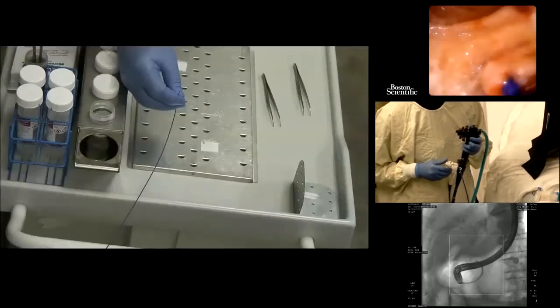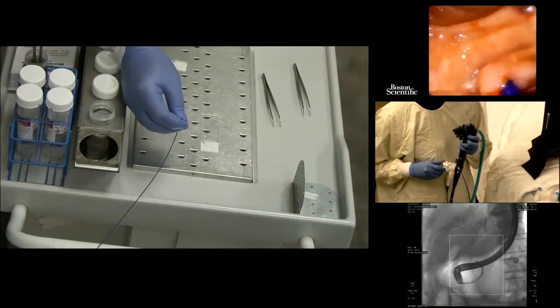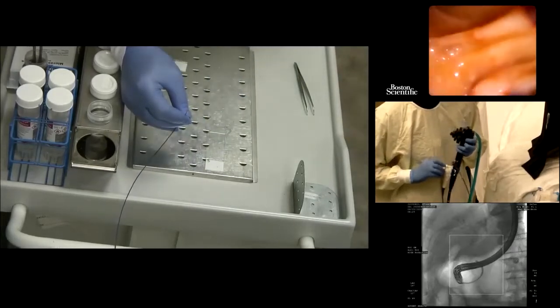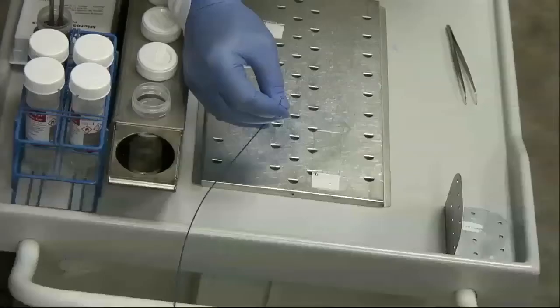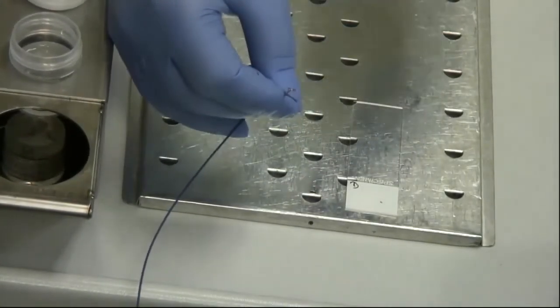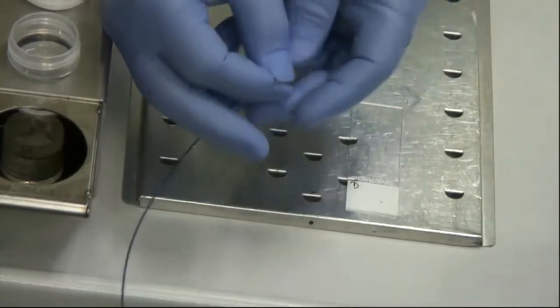We are going to demonstrate a couple of things today. We want to show you how you can process a cholangioscope biopsy on site. So let's go to Conrad. We would like Conrad on the main image. We're getting that? Okay, excellent. All right, so we're going to open the biopsy forceps so that we can show you the type of tissue we get. Let's zoom in on Conrad's hand. So you can see the piece of tissue that's attached to the end of the forceps. Maybe you can angle it a different way, Conrad, so we can see it separated out.